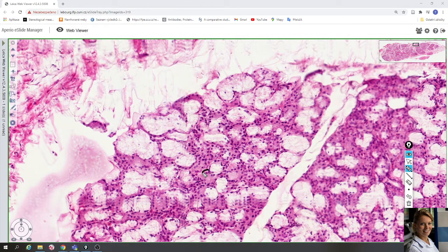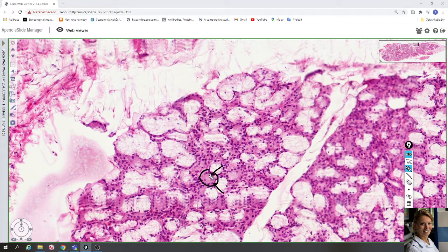The serous cells have round nuclei, for example here and here, in the basal compartment of these cells, and their cytoplasm is darker and contains secretory granules.